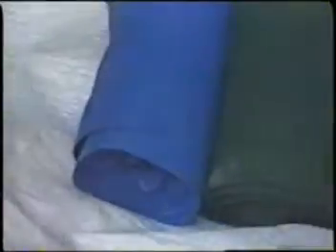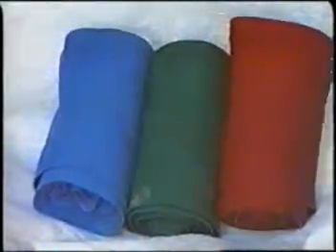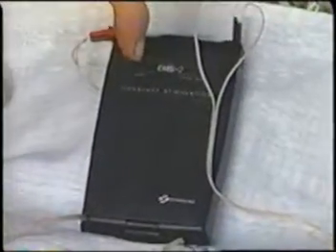Now, this is the stimulator laid out. You can see the little electrical muscle stimulator. These are the pads. These are the bandages which hold it in place. There's the bottle with the contact lotion. That's the stimulator itself.